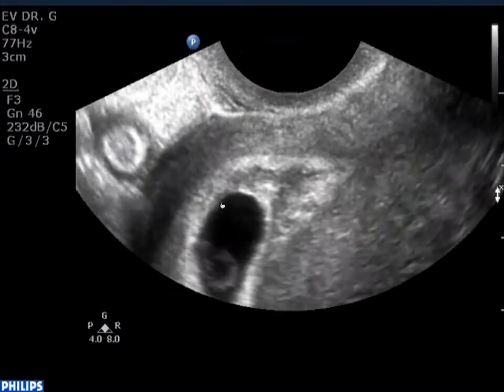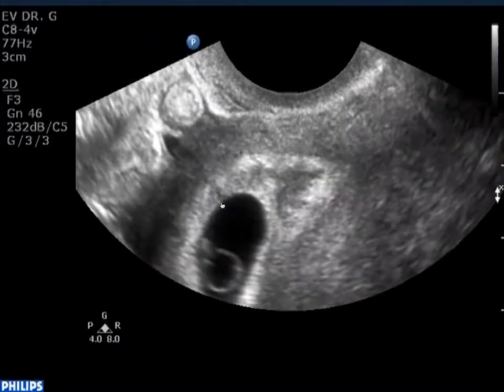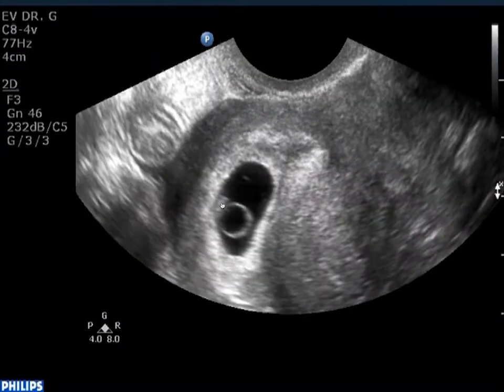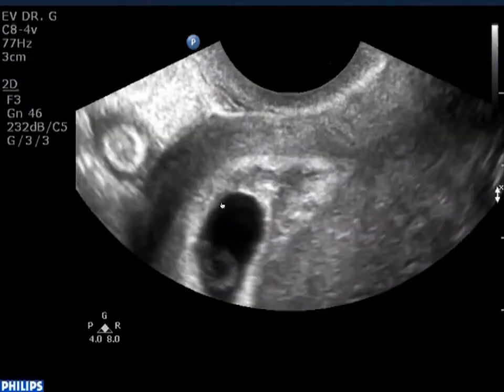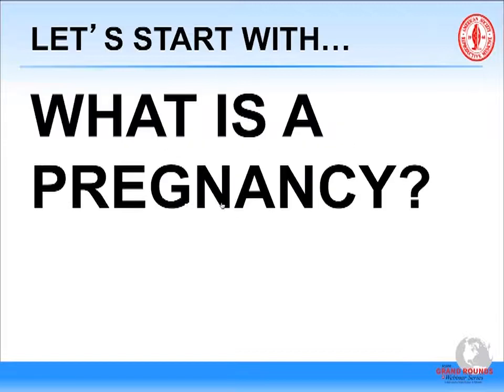It is as if we're doing ultrasound through a low-power microscope. And that's one of the beauties of the technique, but also sometimes some of the foibles. We see every little ditzel the pelvis has to offer. So I say here early pregnancy, I think, has undergone a major change in the playing field.